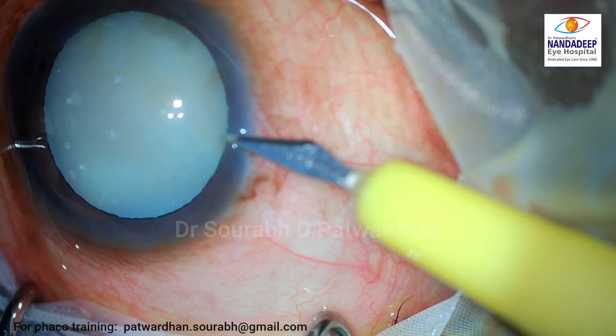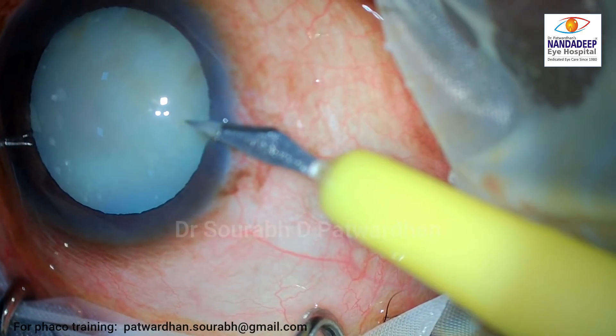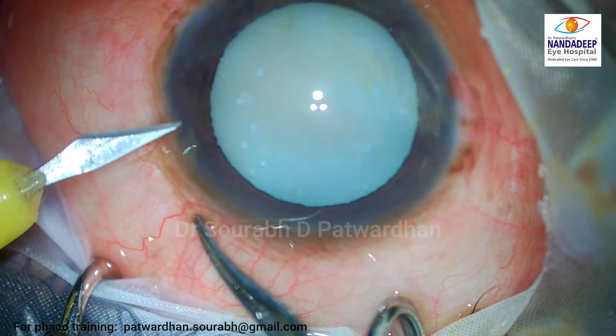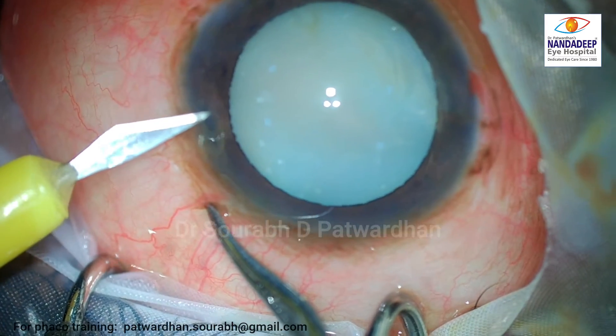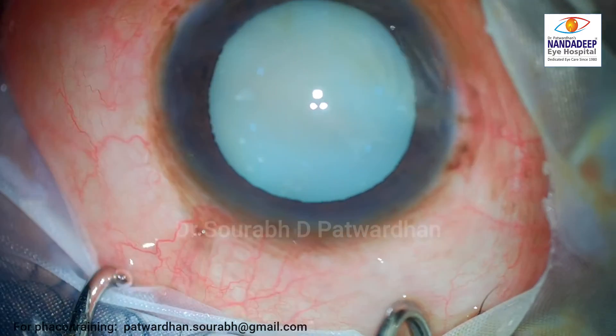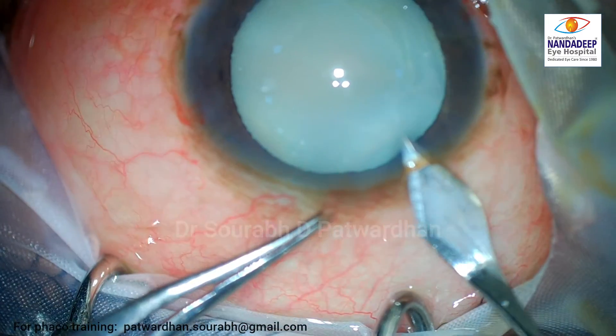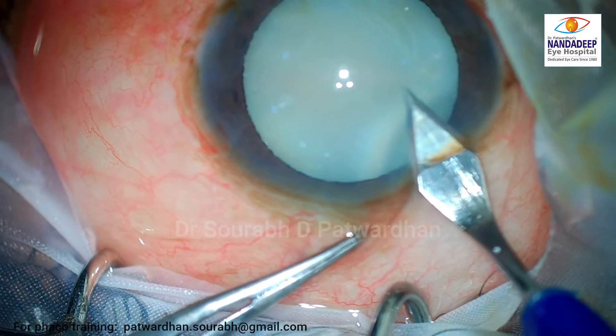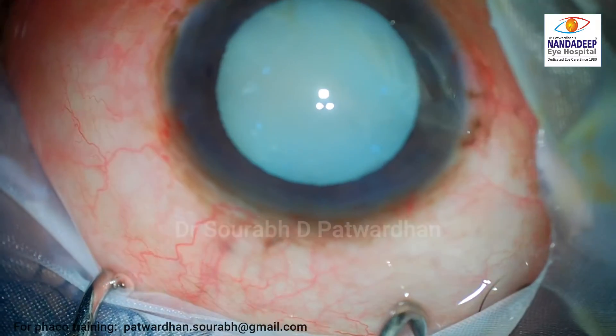This surgery was started by a younger colleague, and let's have a look at how the surgeon decides to deal with this case. Because it is a hypermature cataract and the surgeon has planned to use a cystitome, two side port incisions were made — small in size — and one main incision was made.